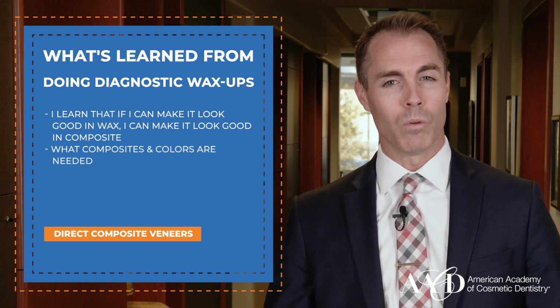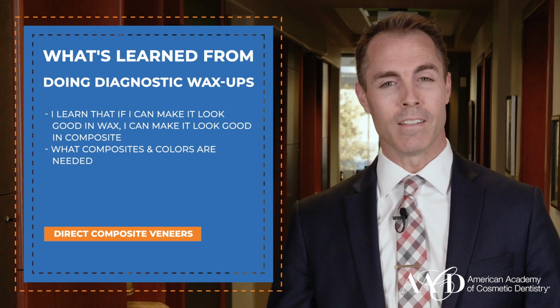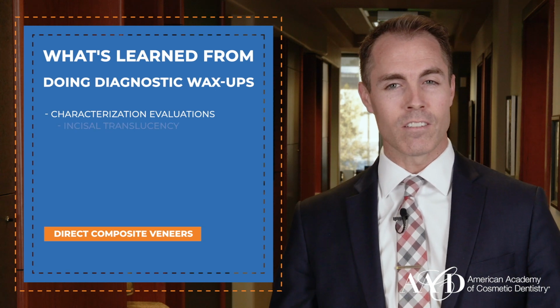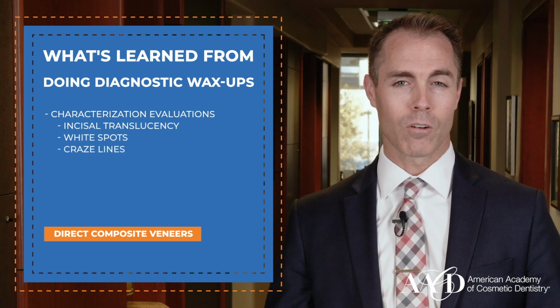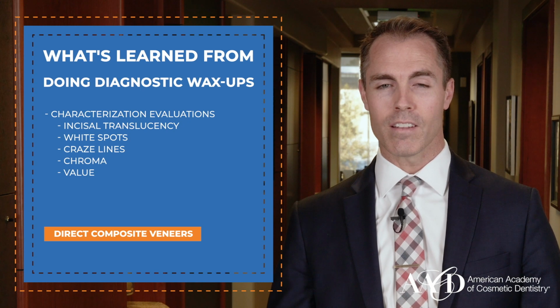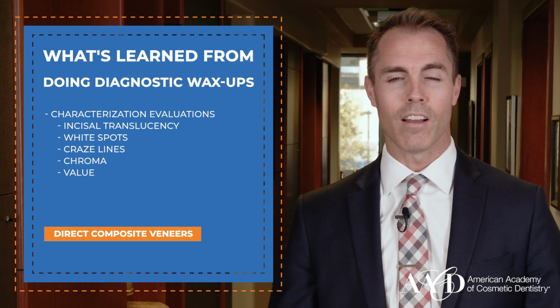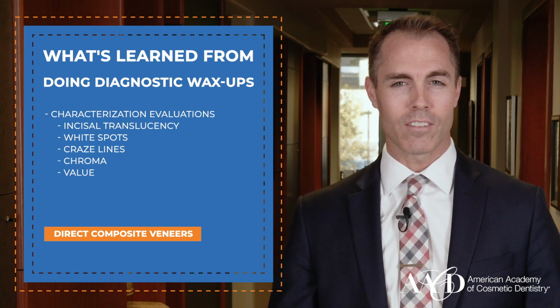I can think about which composites I want or need to use and which colors will be needed. Each case is unique. I evaluate characterizations such as incisal translucency, white spots, craze lines, chroma, and value. All of this goes through my mental checklist as I review photographs and complete the wax-up, and when the patient shows up for their appointment, I already have a mental picture of the final outcome and simply have to execute the formula.